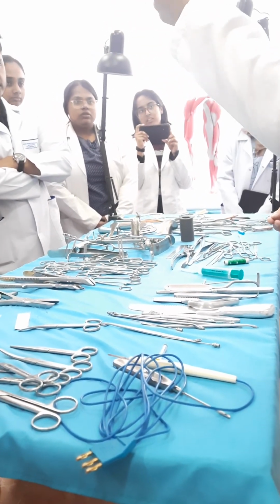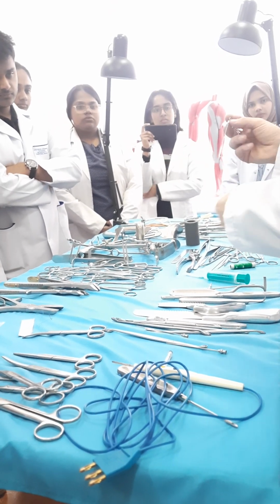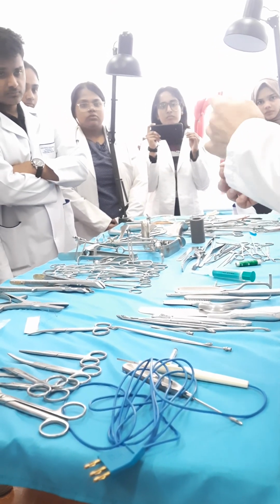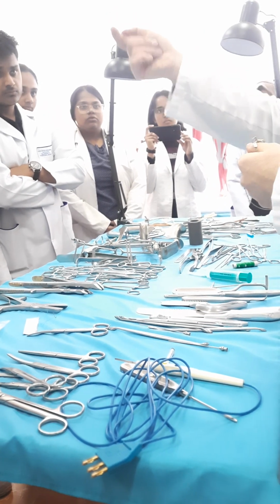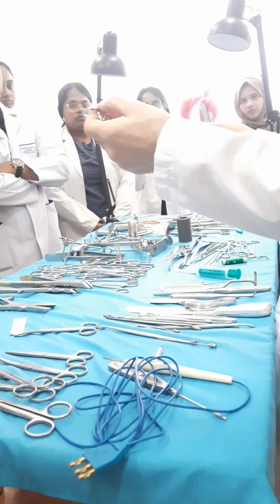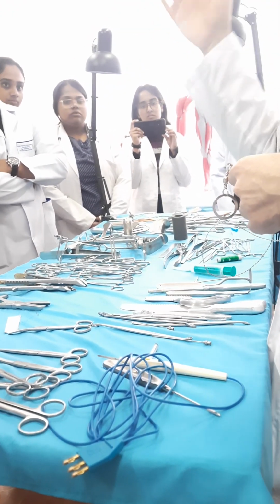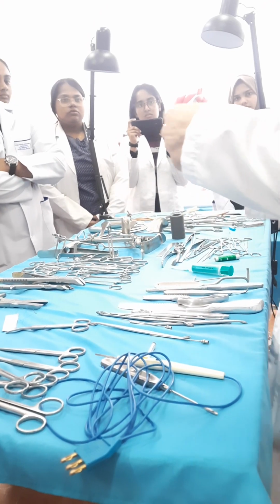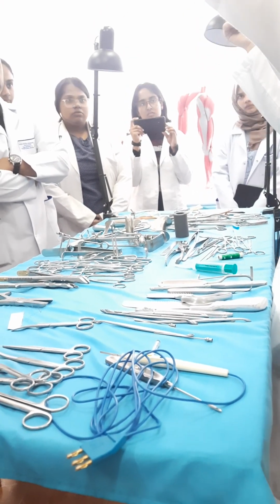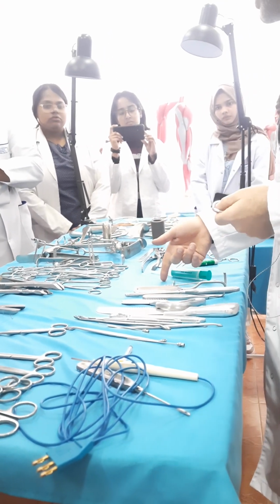We call it the Gigli wire saw. It has a lock mechanism in the handles. You can remove them with a special introducer. You insert it into the bone holes, for example, the trepanation holes, and you make the sawing from inside to outside. Look, if this one saws the bone from outside to inside, this one we usually use to saw from inside to outside. Of course, previously, primarily, we must drill the bone, yeah?